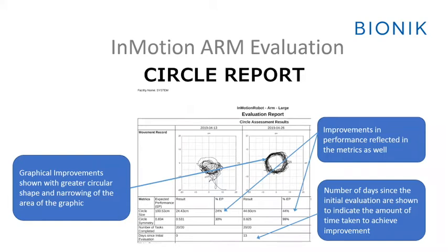We also have a recording of the number of days since the initial evaluation was performed, indicating the amount of time taken to achieve the improvement that is seen in the graphics.